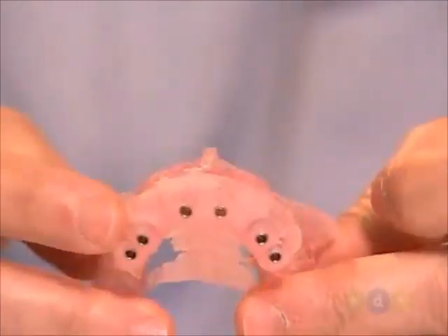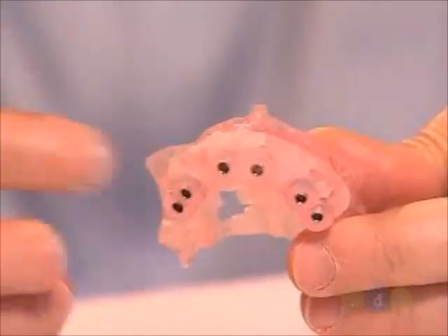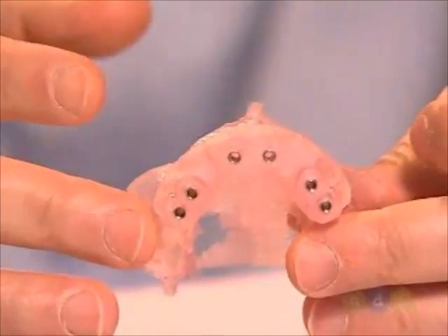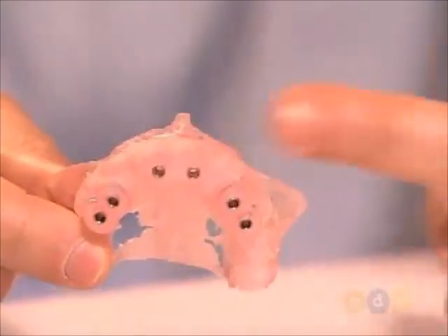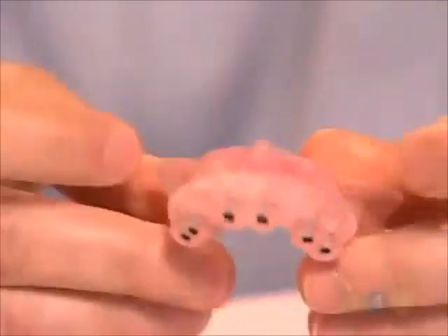An additional issue that I believe will be in the future is you can take this model and drill onto the model and practice your surgery before the patient ever comes in, placing analogs into the stereolithic model and then planning out your abutments and your prosthesis before the patient ever walks in the operatory. I believe down the road what you're going to see is virtual teeth being made on the stereolithic model based upon a wax-up by your laboratory. And it's very possible that in the next few years with this technology, you're going to be able to go right from implants to some form of immediate final restoration in many cases, certainly with final abutments.